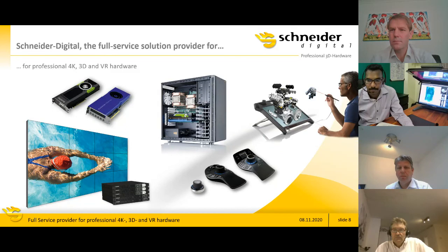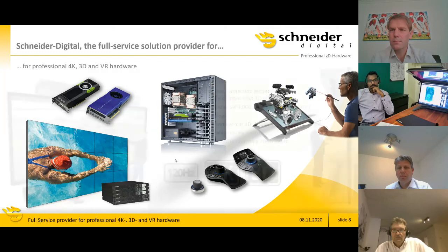And we understand Vesalius software very well. So we know the amount of data that you will likely need, the amount of RAM, what graphics card should be put in there, what your requirements are. And you also see the handheld controllers down here. There are more handheld controllers for fly-through, for working in stereo. If you want to go big, we can also provide complete stereo walls.